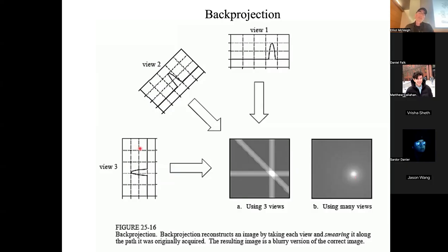So when you do a projection through that, you get zeros until you get to the disk, and then you get this projection of a disk, right here. And then you get zeros. And then when I change the angle, I get exactly the same function. It's just the position of the disk shifts, right? Because this is a tremendously simple image. And so at each view angle, I get a new position of that disk.